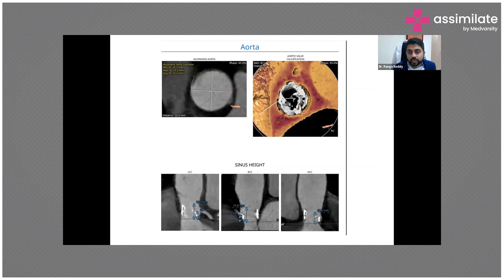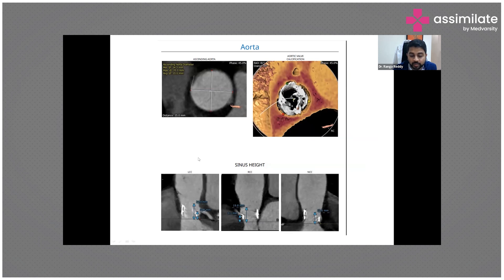Here you can see the annular and valvular calcification, the annular calcification, the height of the coronaries, and the leaflet calcification - all assessed in the pre-procedure CT evaluation.